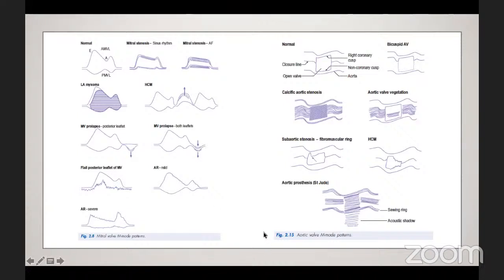But I guess from the surgical point of view, when you read about LV dilation, the diameters help you before assessing for an LVAD. It helps in assessing mitral valve regurgitation and when you think the LV is dilated or not. But I think this is not the main parameter that we use for now. It's just an older parameter. A lot of studies have been based on it, but we're moving away from single plane imaging to 3D and 4D imaging.